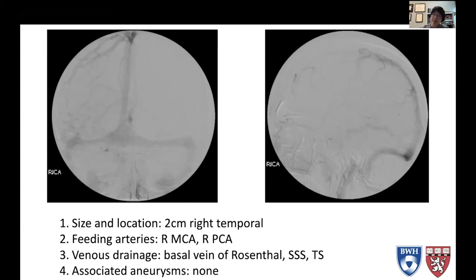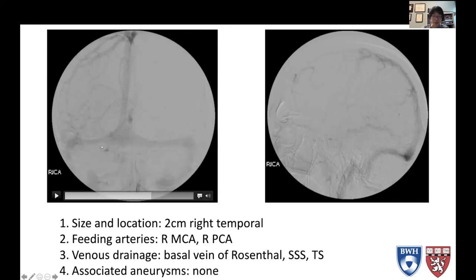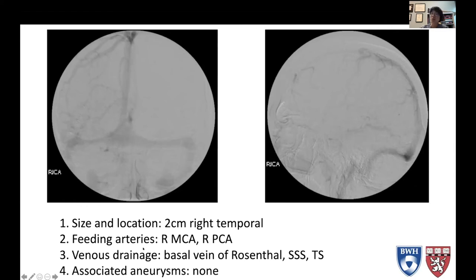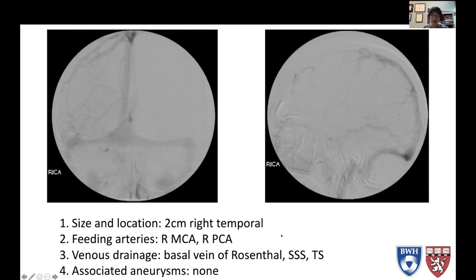You see the normal veins in the venous phase very late. So the way I would describe this AVM is: a two centimeter right temporal AVM fed by the right MCA and right PCA, with venous drainage into the basal vein of Rosenthal, the superior sagittal sinus, and the transverse sigmoid sinus. And there are no associated aneurysms.